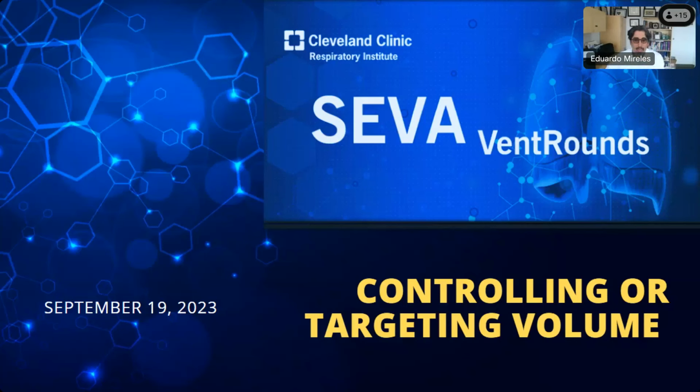Let's get started. Today we're gonna be doing SEVA VentRounds. It's September 19, 2023. And the topic is controlling or targeting tidal volume. To some, this may sound like a common statement, as if it is exactly the same thing, but it's not the same thing. I think we need to talk a little bit about this, and we'll see a couple of examples about it.